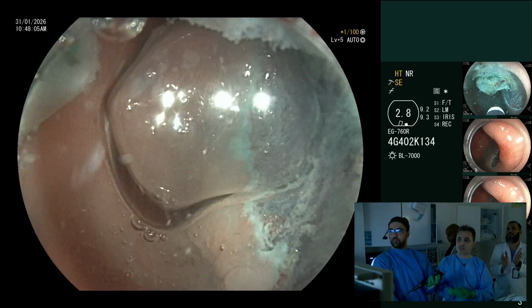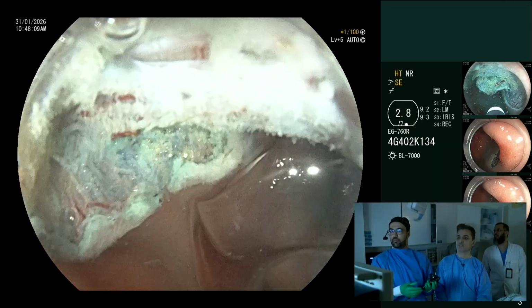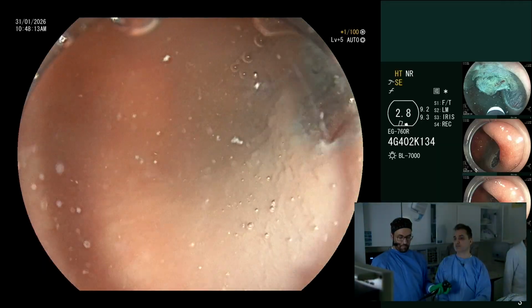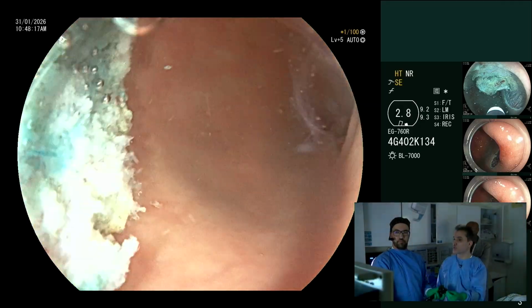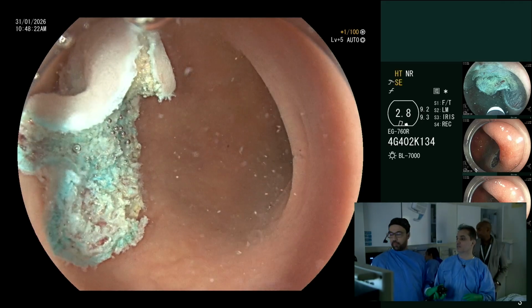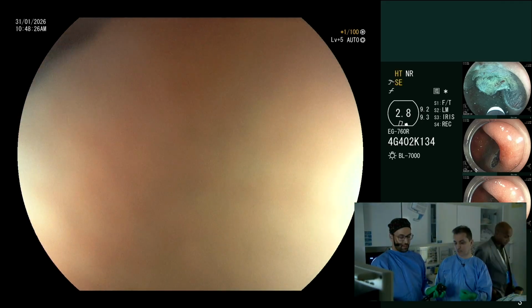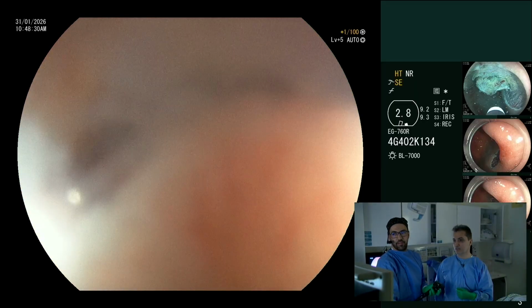The final cut is completed. Good, Dr. Nawaf. Yeah, move now. Thank you. So you put the 2 clips in for safety. Small clips. Can you take the sample out in order to inspect it before you close? Give me. No, give me, brother. Section by section. Small. Yeah, not so big.